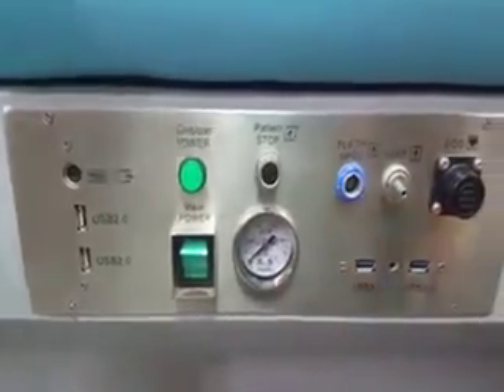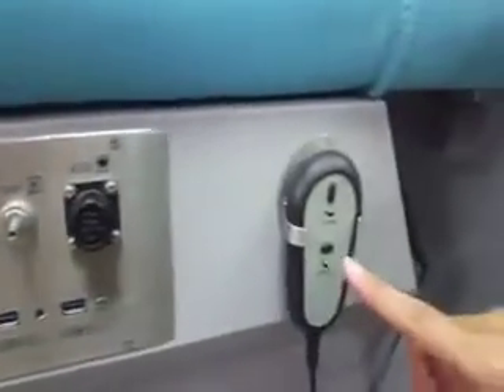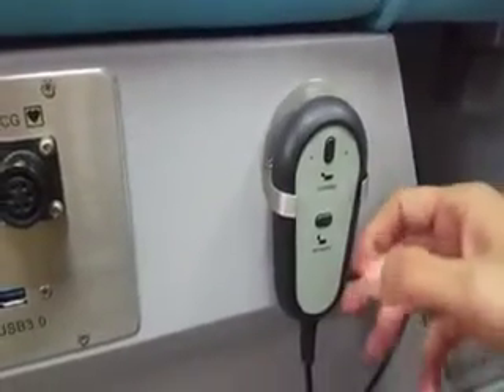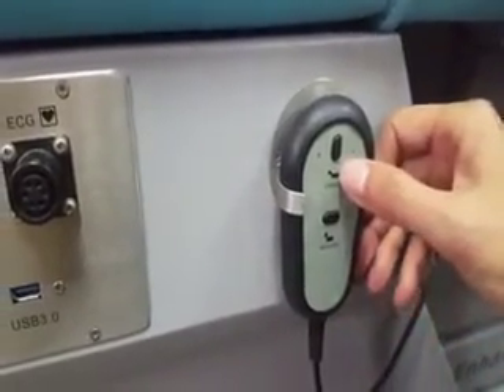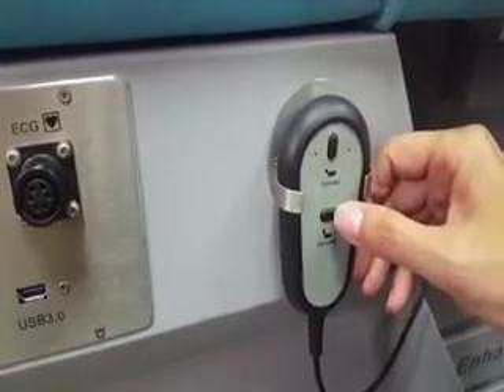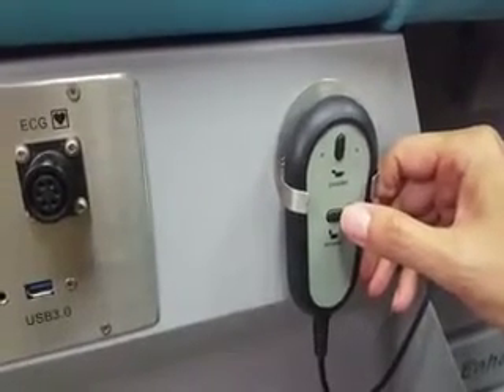Here you will find the bed elevator remote. You can press the up button to lift the bed and the bottom button to descend the bed.